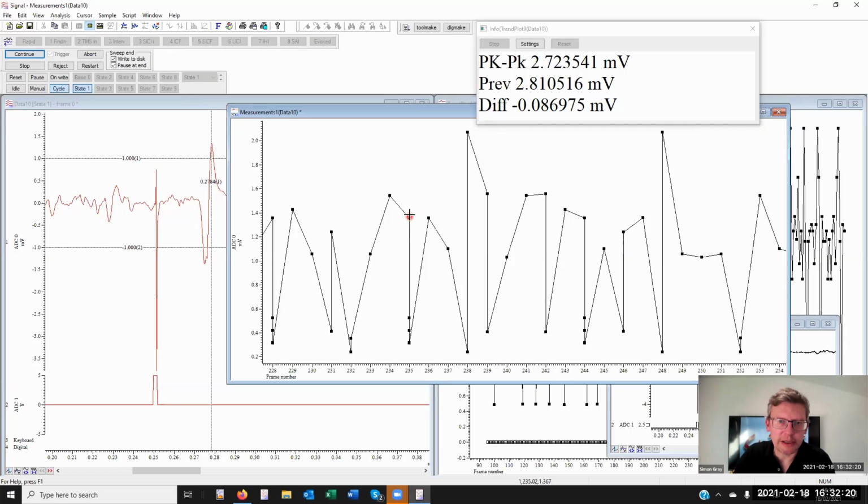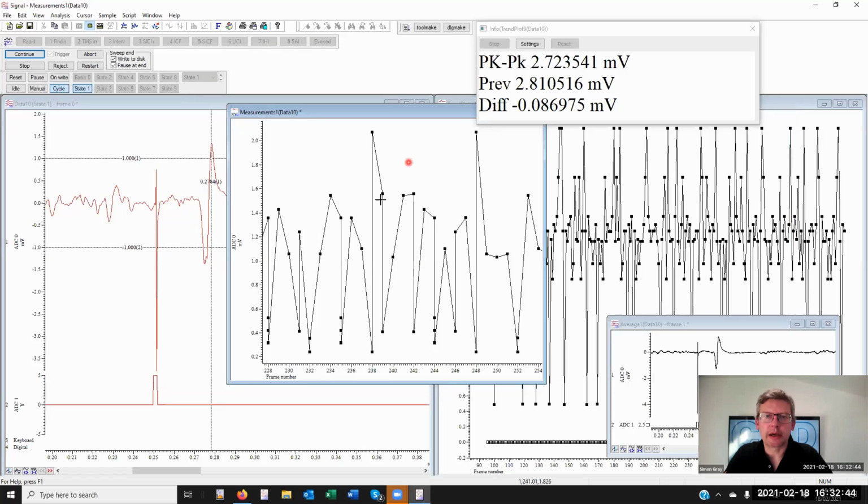Okay, so starting here, we've come into the new frame at this point, that's probably the MEP, followed by 3 other points a little further on in the file with a lower amplitude. And before that, we were going back 1, 2, 3 frames, and there were 2 digital markers indicating 2 triggers, 2 stimuli. So that's the difference between an XY view and an XY trend plot.